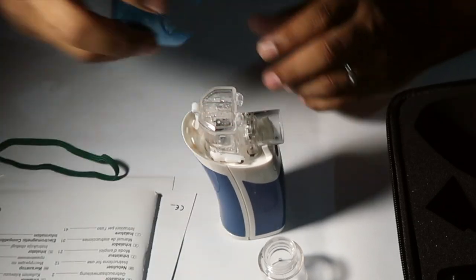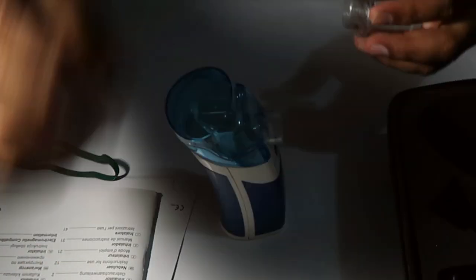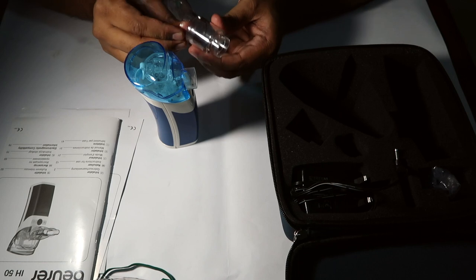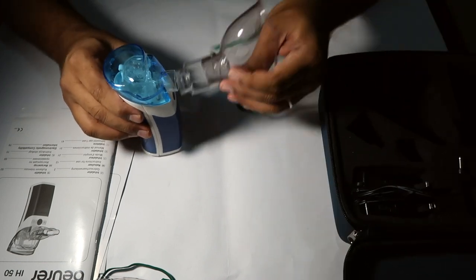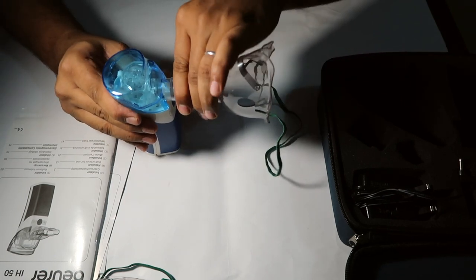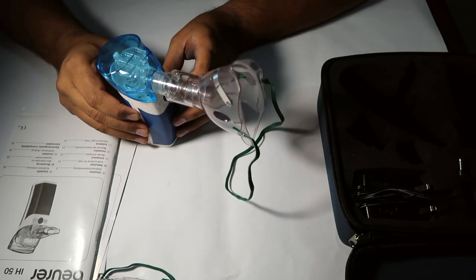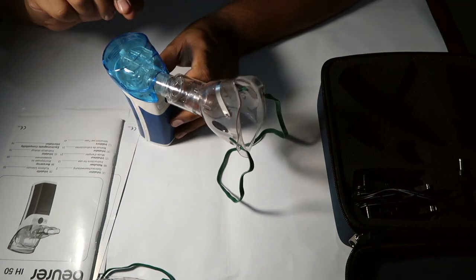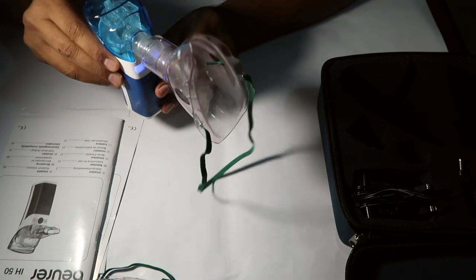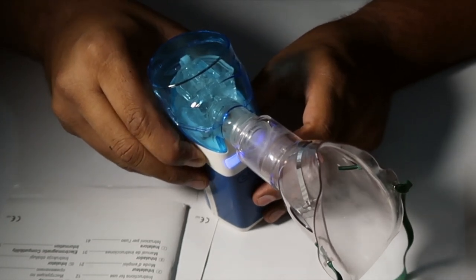Now we'll put on the cap and the mask. This button is on the left. The medicine can be automatically switched off. Now the machine is on. We have to use this vapor — this is the nebulizer machine in action.